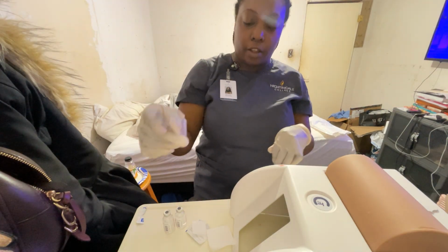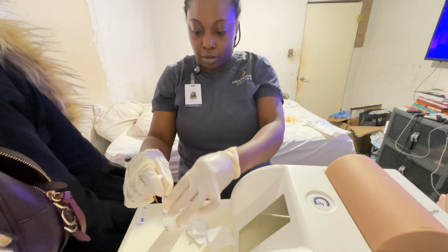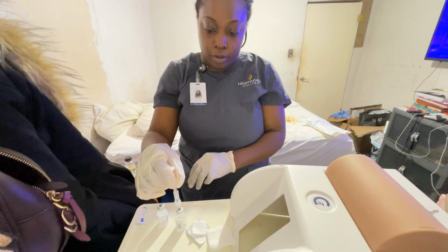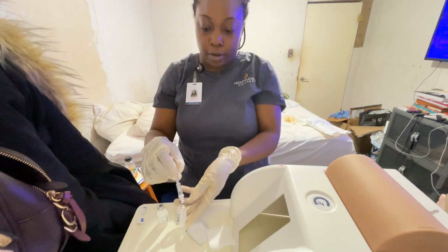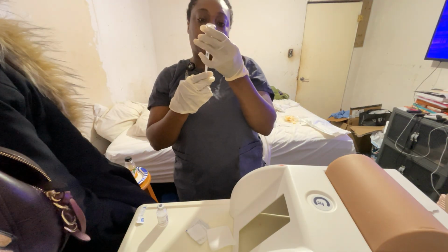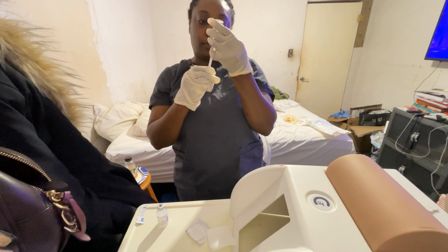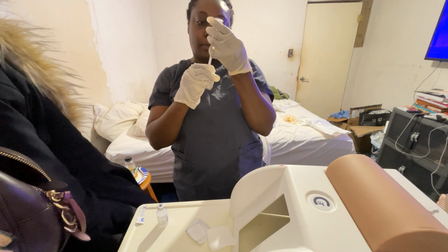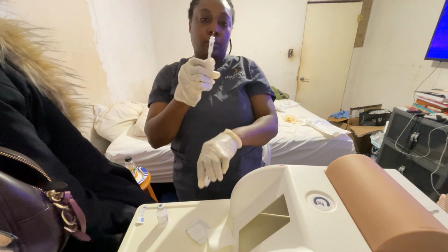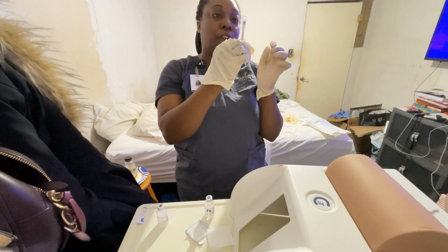There's 8 units of air. Injecting into that vial. I'm going to go back to this first vial here and pull back 4 units. And 4 units. Ensuring I have no air in there.